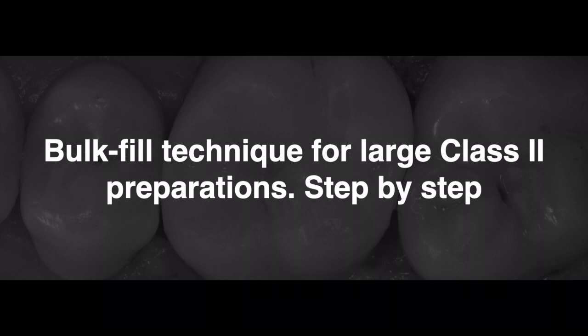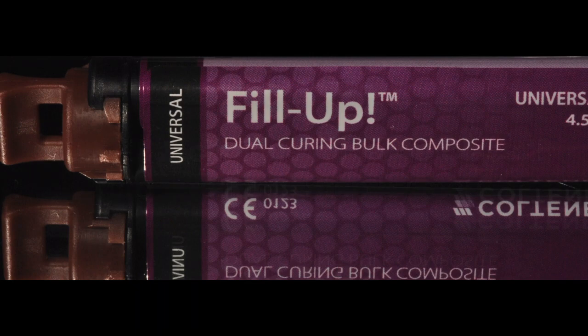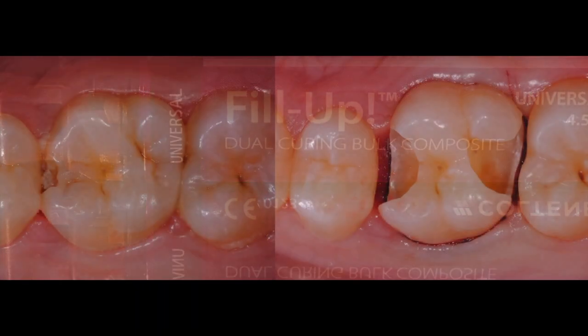We are going to restore a class 2 preparation using Fill-Up! dual-curing Bulk Fill Universal Shade. After preparation is completed, we place a retraction cord around the affected tooth to aid in rubber dam inversion and ideal isolation of the tooth.